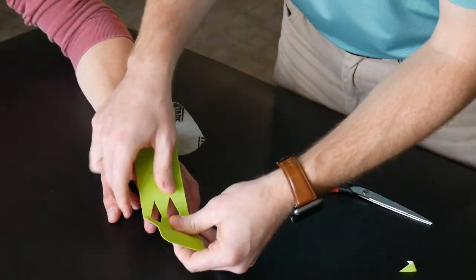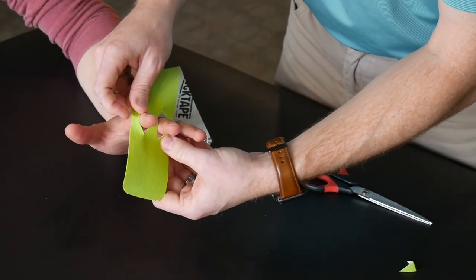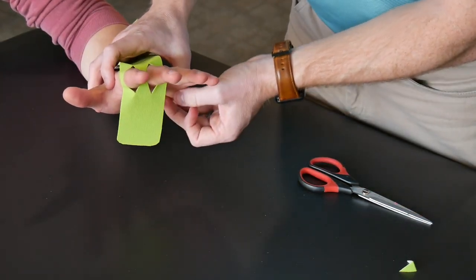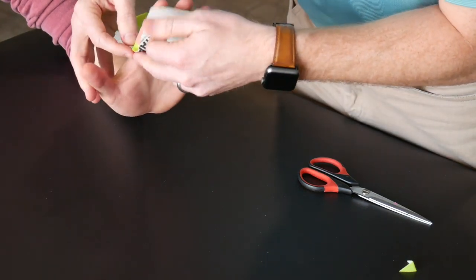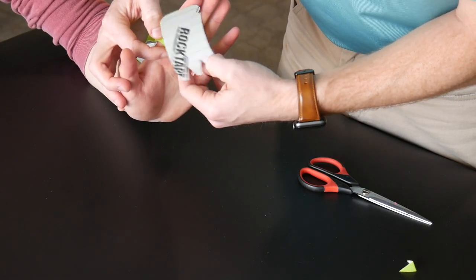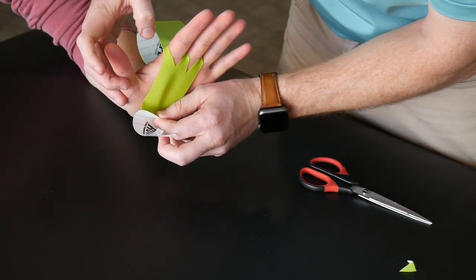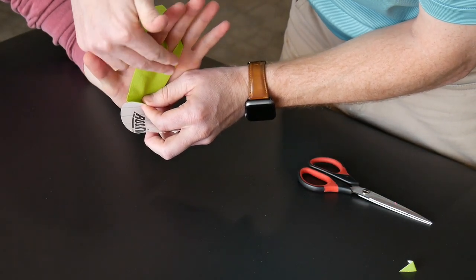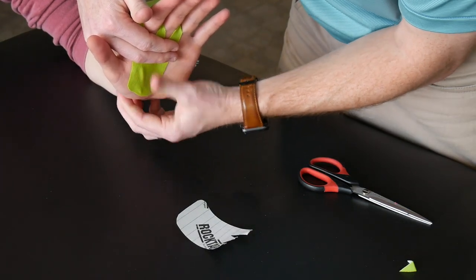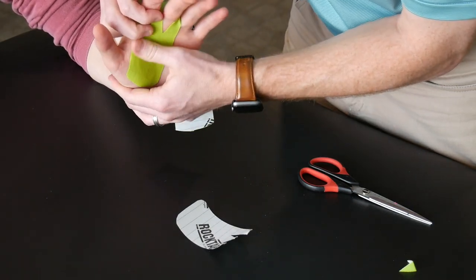So we'll go ahead and thread their fingers through. The smaller side is going to go towards the palm side of the hand and you'll thread that all the way down into the palm just like so. Now we'll go ahead and take the palm side, pull all that tape back, and then we're going to anchor it into the palm. Remember to rub that really well so you can activate that adhesive just like so.